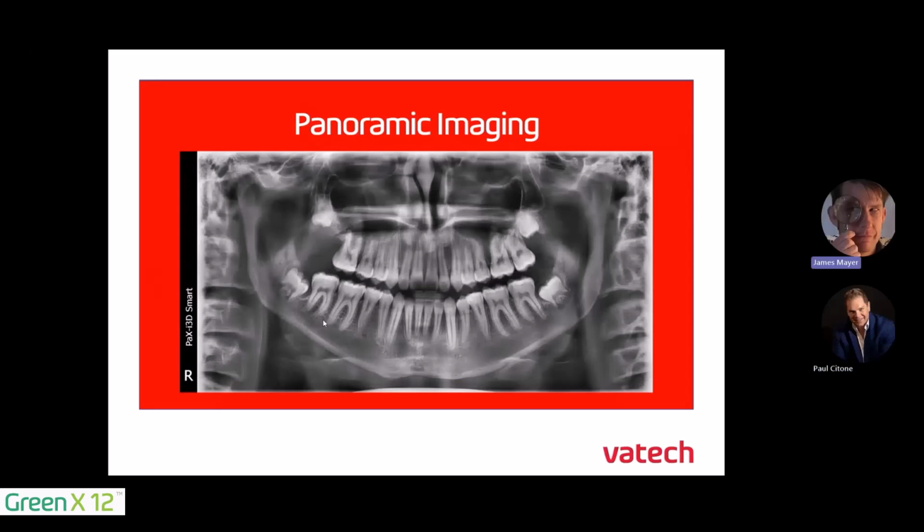So Paul, I think that concludes our review of the panoramic imaging troubleshooting or image IQ. I think the main things are ensuring that we are positioning the patient properly and taking off the jewelry, which should result in a clinically diagnostic image.